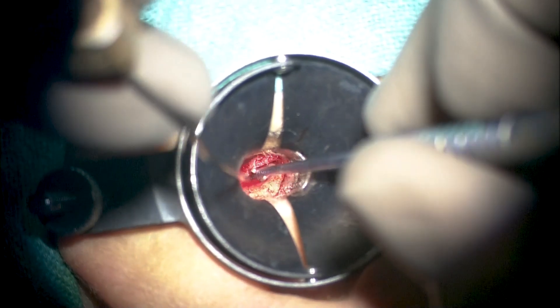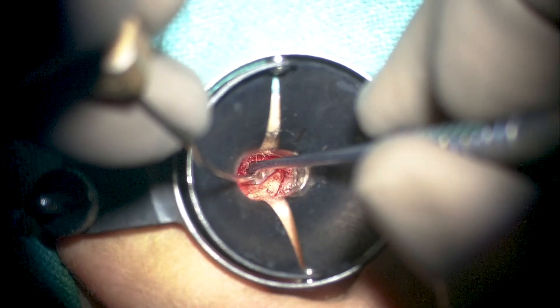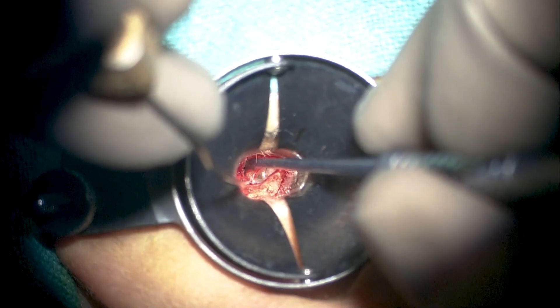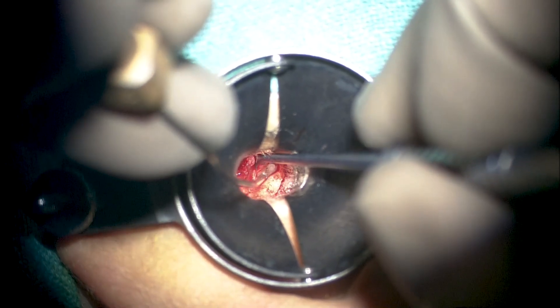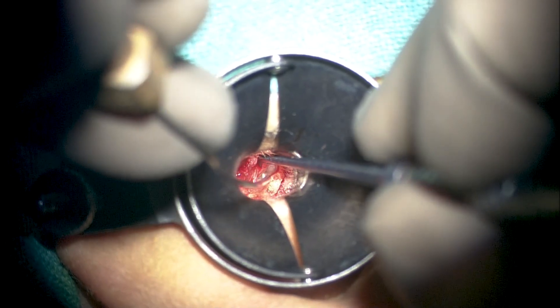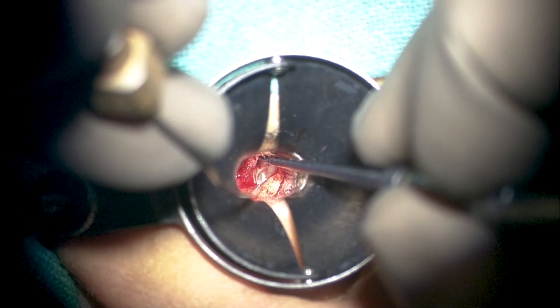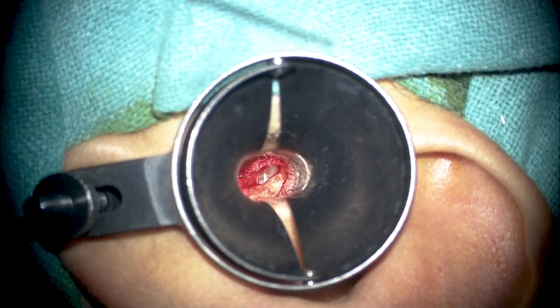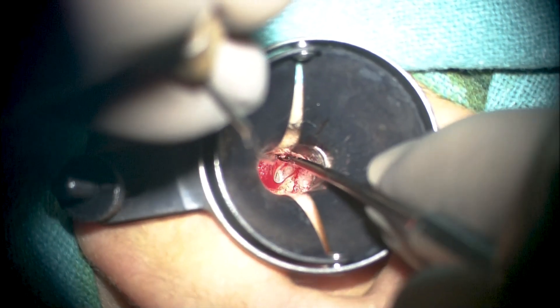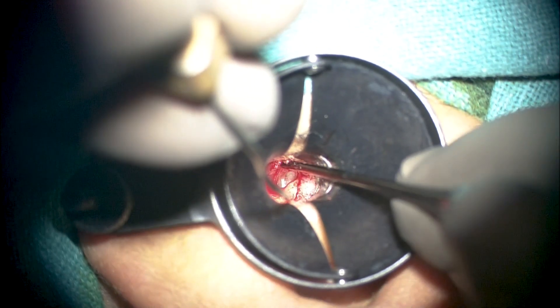As we enter the middle ear, we begin posterior superiorly and gradually make our way towards the posterior inferior quadrant to elevate the entire canal skin. It is very important to create larger flaps because they are less amenable to tearing compared to very narrow or tunnel-type flaps. As tension over the canal skin increases, narrow flaps will most certainly tear off.